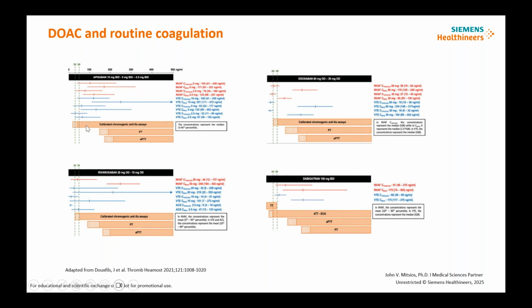So a greater than 50 nanograms per ml allows the antidote to be clinically effective, allows it to properly reverse the anticoagulant effects attributed to the anticoagulant, in this particular case, apixaban. Studies have shown that if your concentration of apixaban or anti-10A DOAC is below that 50, then it's clinically ineffective. So there's really no need. It doesn't add anything to the overall reversal of the anticoagulant effect.